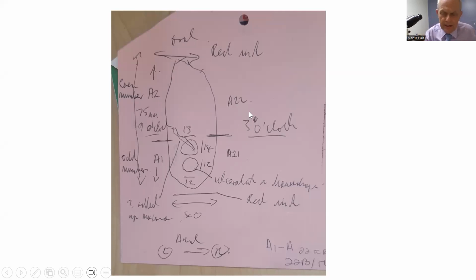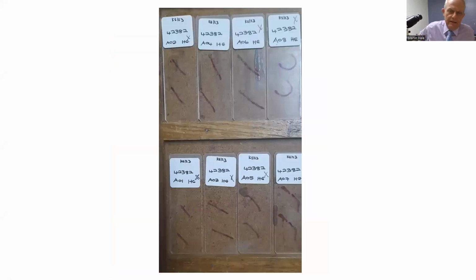Now, when I look at it, this is what it looks like. So I never look at the sections without this, and if we look here, I've got A1 and A2. I've laid these out purposely like this because I'll start off at A1. So now I'm visualizing what I've put through, that this is the first block there, that's the second block there. So I'm basically going from one end to the other end.